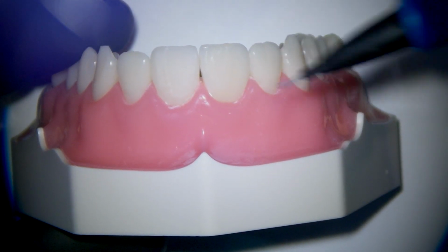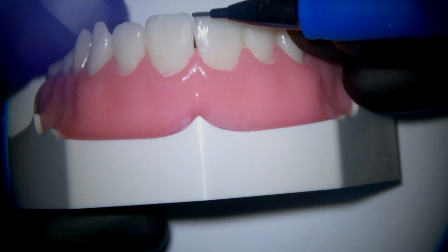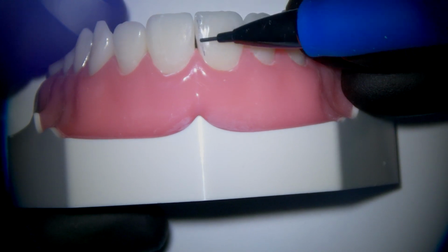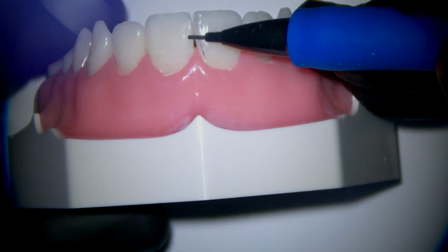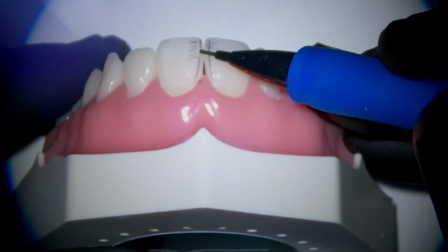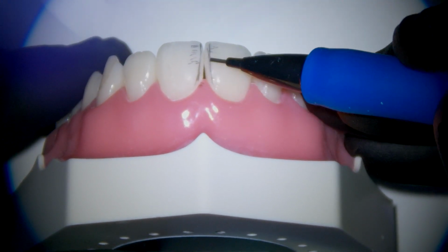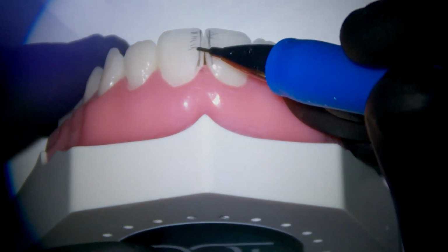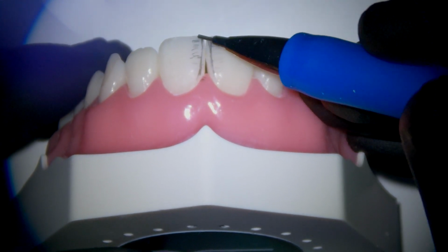Now, before I start the contouring, I want to identify where the height of contour is for my line angle, as we talked about during the presentation. So in this case, I'm going to sort of draw where I want my line angles to be. I see on my right central incisor and my left central incisor, I want to mimic that. So I'm going to start blending the composite in, avoiding going past that line angle because I want to keep this in a zone where I'm going to be polishing back in here and then in a separate step polishing into that line angle. So just using my disc to trim that back.